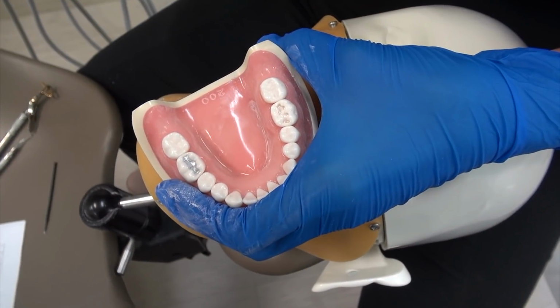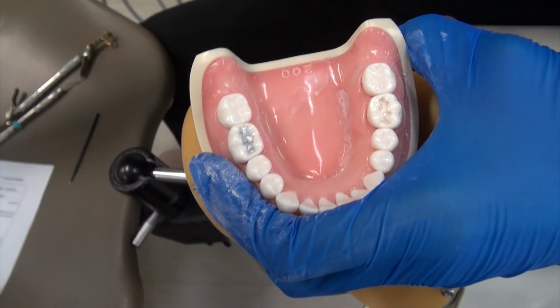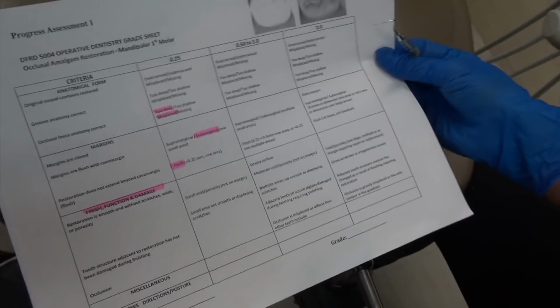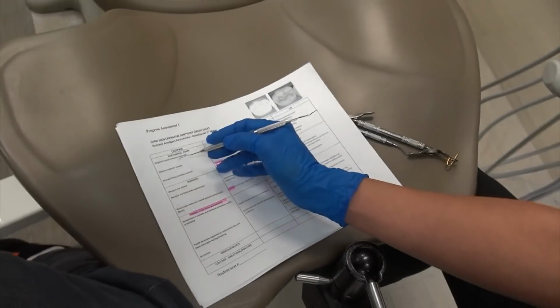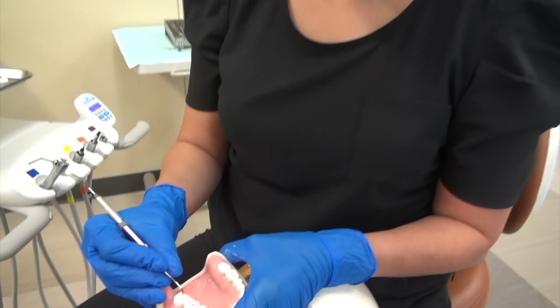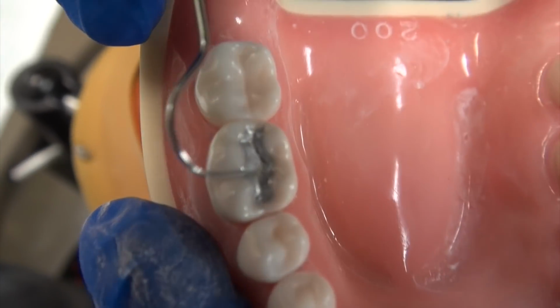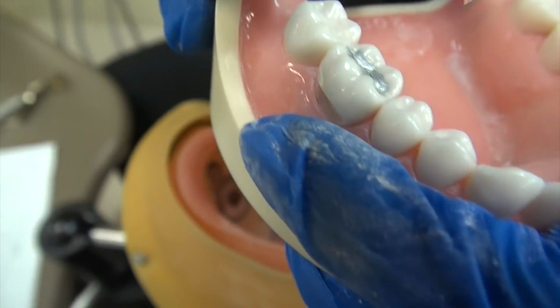Okay, one of the most important aspects of the preparation process is making sure that you're properly self-assessing. So you always want to have your grading criteria. This is the sheet that they're going to use to grade you. They pass out one of these in class. You always want to have this out and go through each criteria and ask yourself, do I have my original cuspal contours of the restoration? Now, as you're doing that, you want to go through and make sure that you maintain those hills and valleys, because that's really what they're going to be looking for. Do you still have that anatomy?